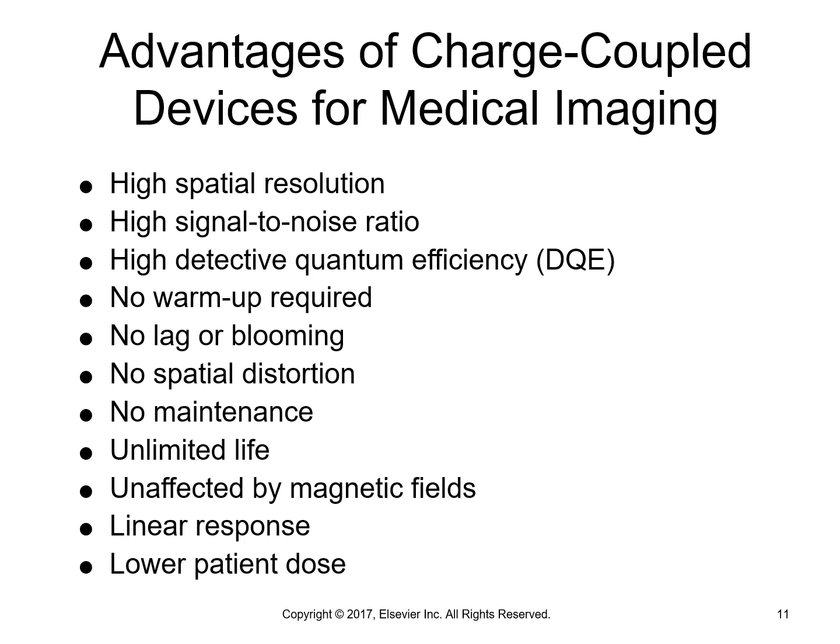Okay? So no warm-up needed. Typically your television camera actually had to get hot. There was part of it that had to get warmed up. You had to pass current through it until the components warmed up, and then it could run just fine. And so there was a little lag with the technology, as you got to turn the machine on and get it up to temperature, and then the component worked as described. Okay?